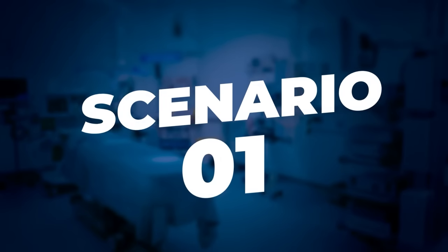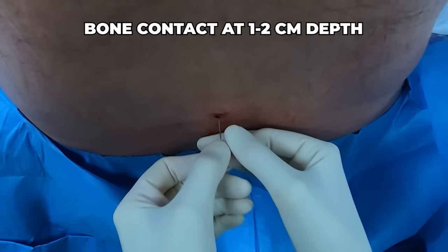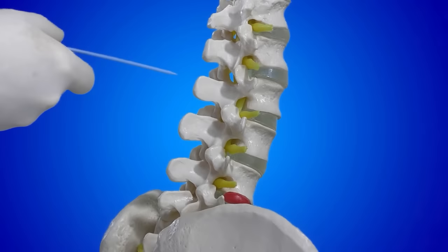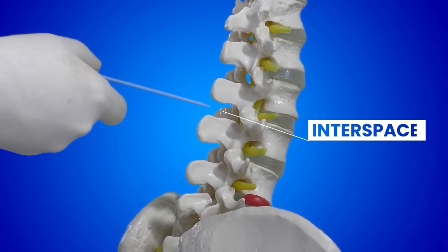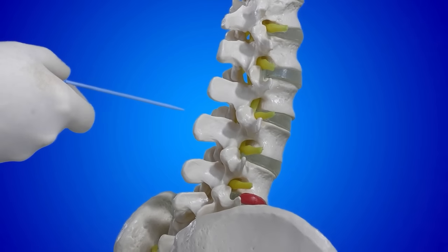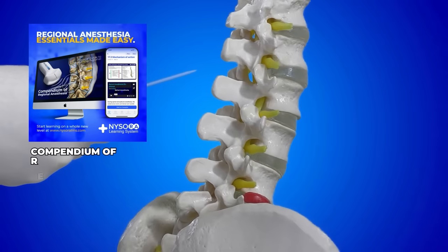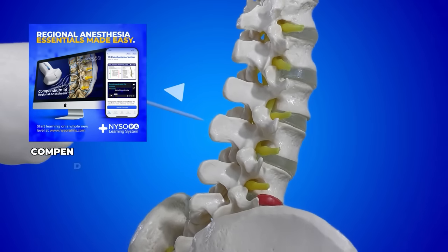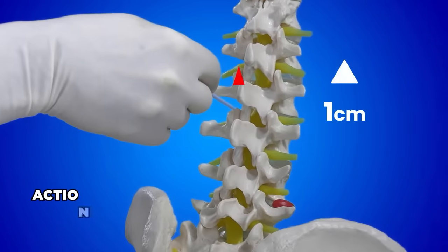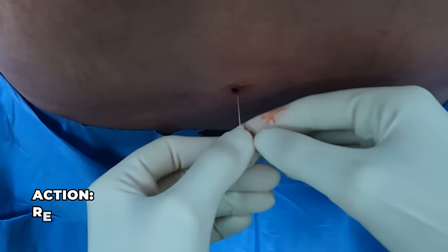There are four typical scenarios. Scenario number one: the needle touches the bone superficially. When that happens, it means we are in the midline but not in the interspace. The course of action is to take the needle out completely — do not reposition by reorienting cephalad or laterally. Rather, reinsert the needle one centimeter up or one centimeter down to place it in the interspace.